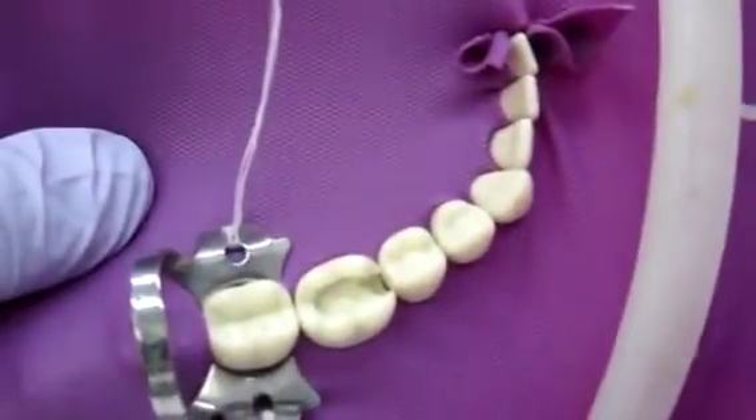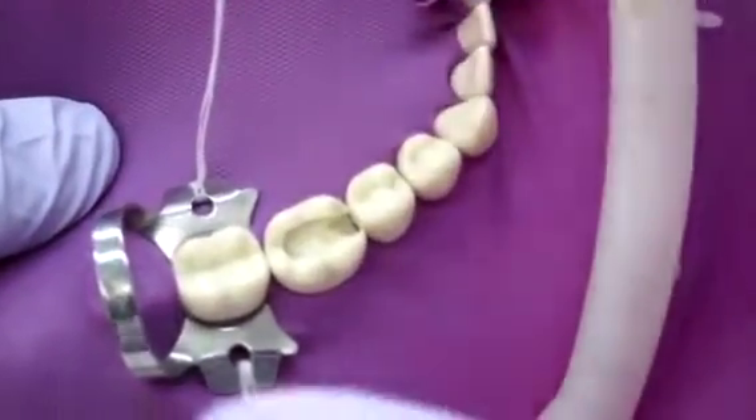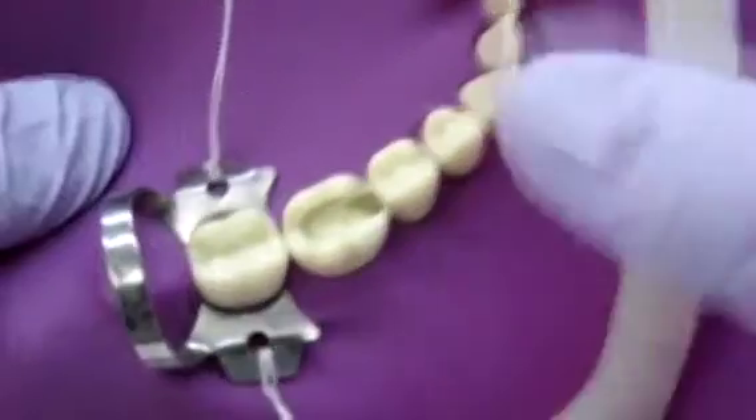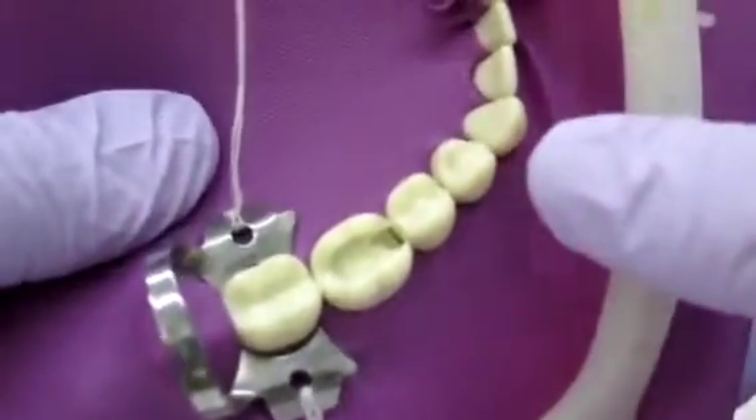I'm going to do this tabletop so that the camera can really see it and you guys can actually see it. Of course, you're going to have to do this in the mouth, and you're going to have to figure out how to position your hands and everything.